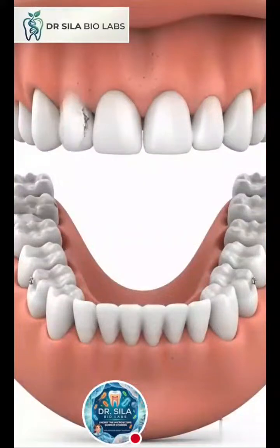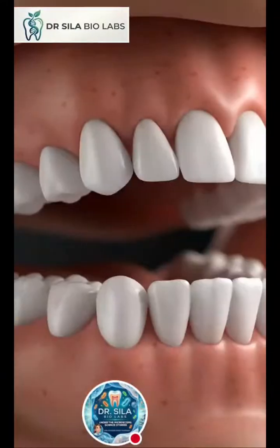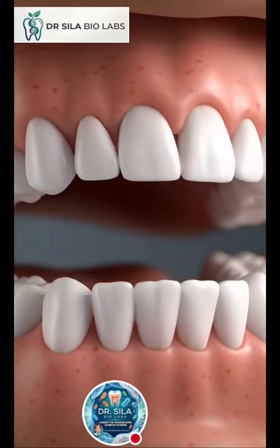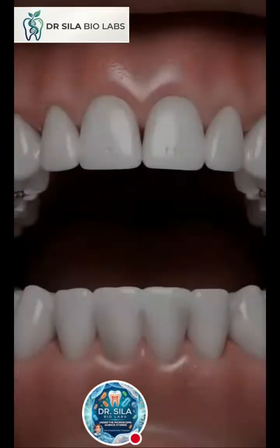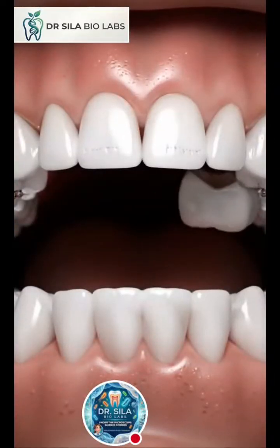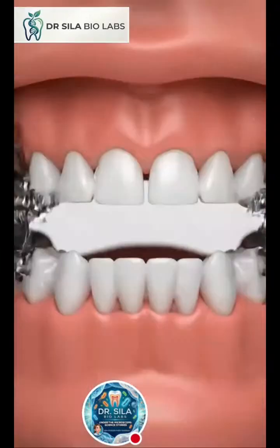This 3D animation showcases the dramatic transformation of correcting severely crowded and misaligned teeth using a combination of treatments. The story of the treatment unfolds in these distinct phases. The starting point. The video opens with a view of a patient's upper jaw, showing a narrow dental arch and intense crowding. Some teeth are completely blocked.